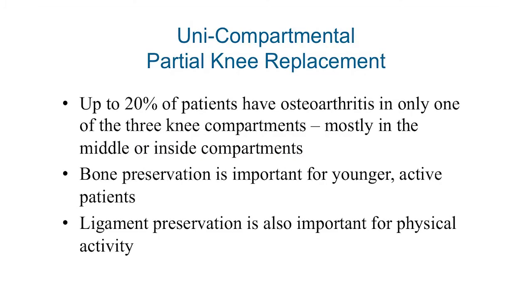Now we go on to the scary stuff, which are the surgical solutions. So depending on the pattern of the arthritis, some people are candidates for partial knee replacements, but it's only really if it affects principally the inner side of your knee, that medial compartment. We can do them on people who have arthritis in the outer part of the knee, but they haven't shown the long-term results that we would like of the inner partial knee replacement, or even the patellofemoral joint, the kneecap joint.